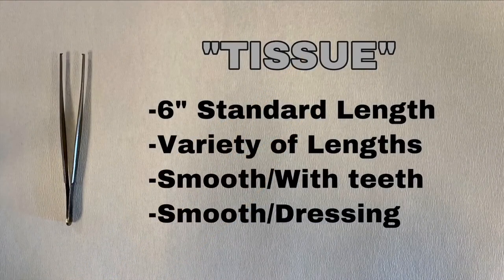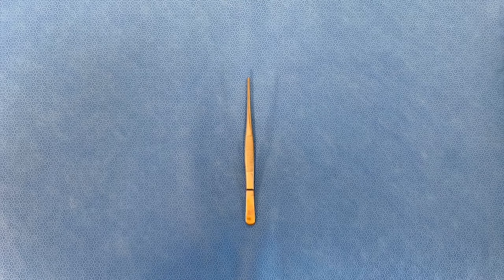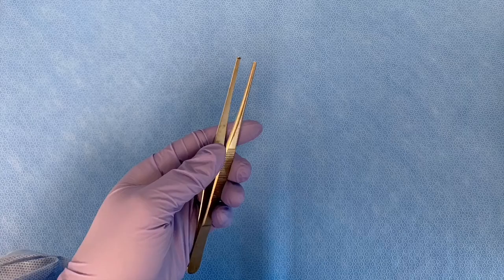This is the tissue forcep. It comes in six inches in standard length and a variety of lengths. It can be smooth or with teeth; the smooth version is called a dressing forcep.